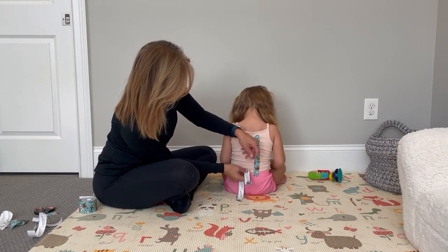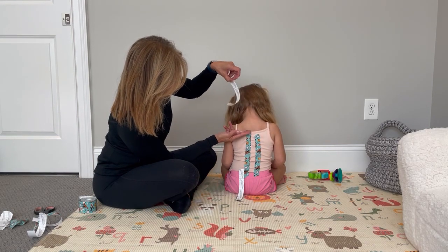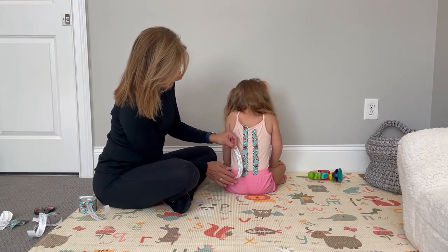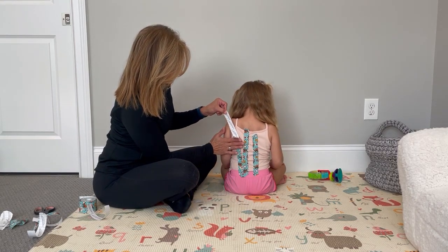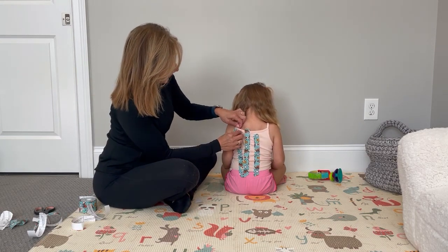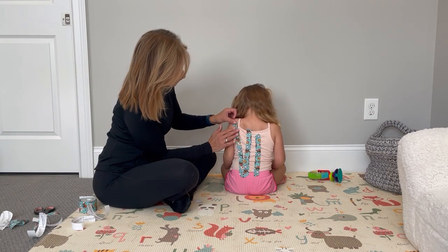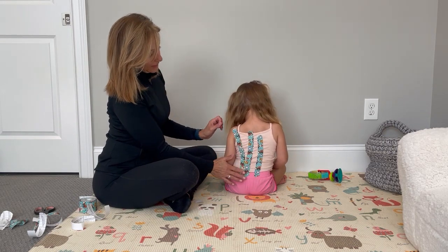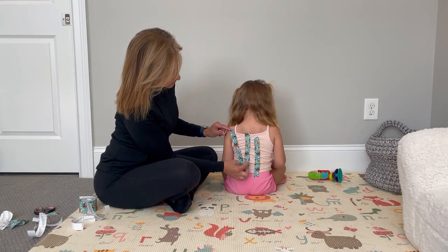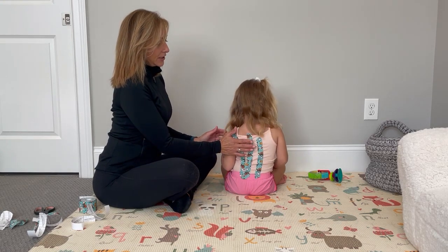Going to put one piece of tape right along the spine, paper off tension, just like we did the first piece. But the second piece, you're going to bring up to the side. So see how I'm able to catch her shoulder blade? And you could even bring it up higher, up here, towards the shoulder. And then you would rub it in if you were going to keep it on. So as you can see, you could do 2 I strips or 2 Y strips. And that's going to help her sit up straight and use her shoulder blade.